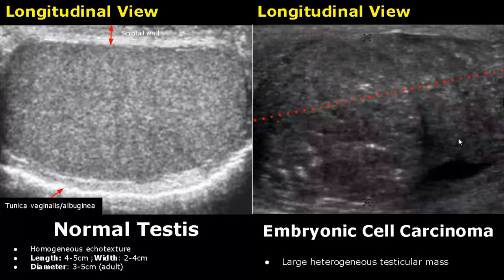Embryonal cell carcinoma is a malignant lesion of the testis. It can appear as a large heterogeneous testicular mass.